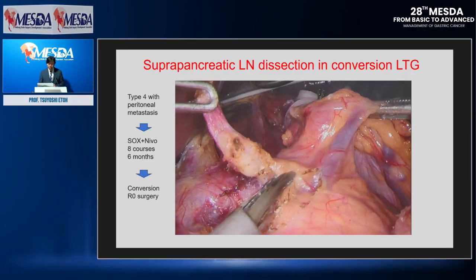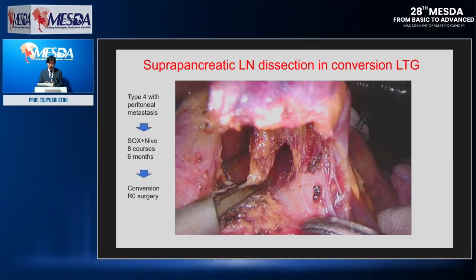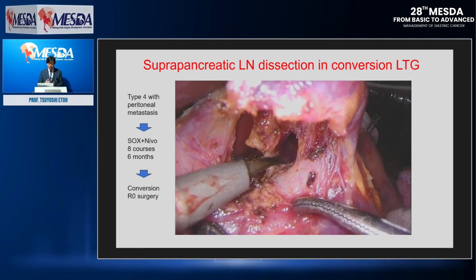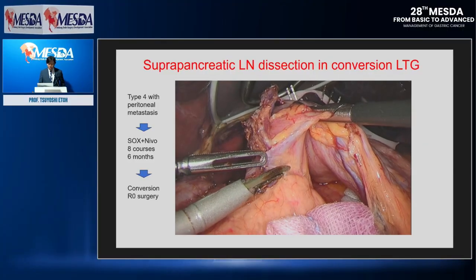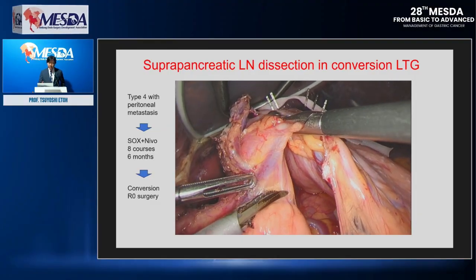Firstly, as I said, understanding the deposit is very important. Where is the safety area? Where is the safety zone, and the wide and narrow space? We always continuously make sure of this, understanding the opposite side.